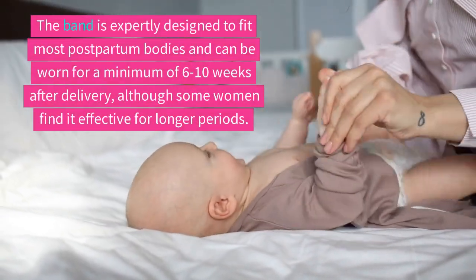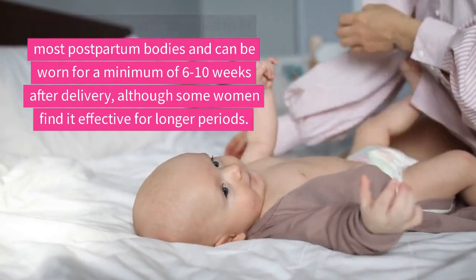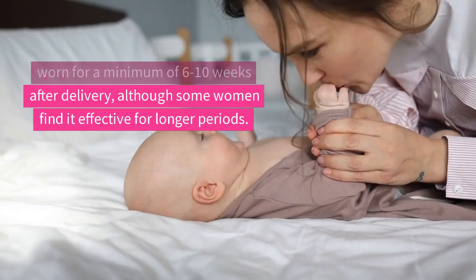The band is expertly designed to fit most postpartum bodies and can be worn for a minimum of 6-10 weeks after delivery, although some women find it effective for longer periods.